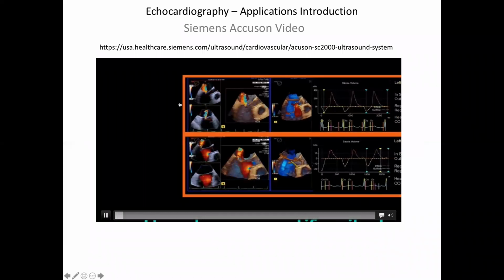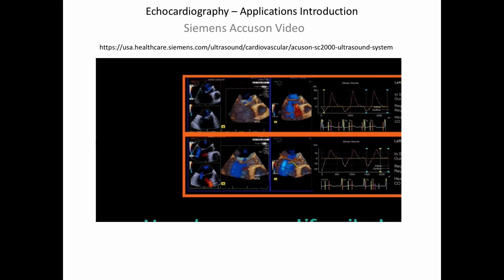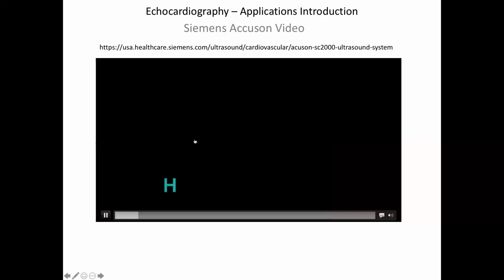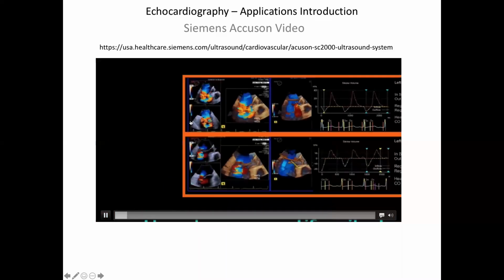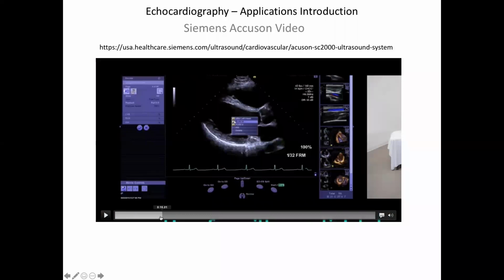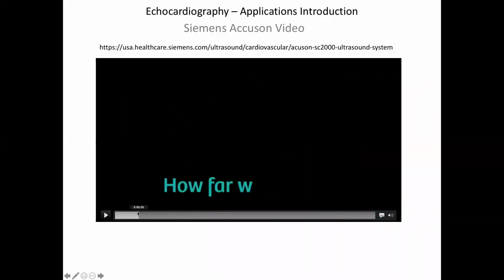Okay. So here we've got... So it's interesting, right? When it's static, you look at it and you're like, oh, I don't know what that is right off the top of my head. And then when it goes dynamic, right, it's obvious what's going on here, right? So we have probably a mitral valve there, sorry, with these jets rendered, right? And then probably what we're gonna, sorry, this is marketing prep. But look at these pictures. I mean, that's beautiful, right?